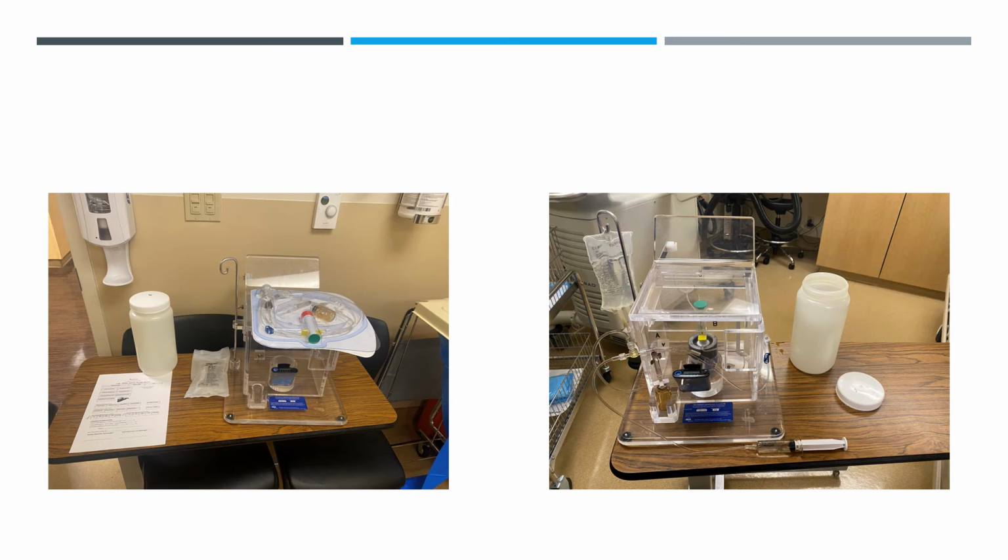They unhook it, they give you the tubing, and then you have to dispose of everything, the tubing and everything, into that cylinder can to the right of the box in the right picture, with the cap and everything. That's what you're going to use to dispose of all the radioactivity. And they keep it in a hot lab, behind this huge L shield, to let it decay away.